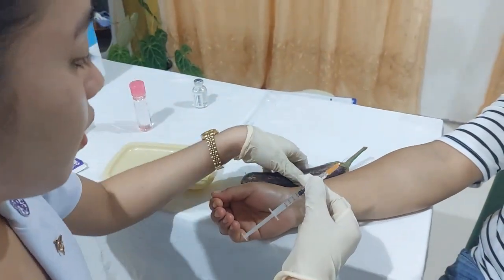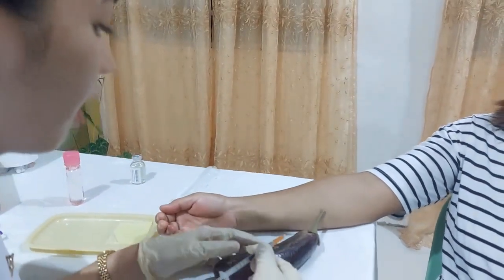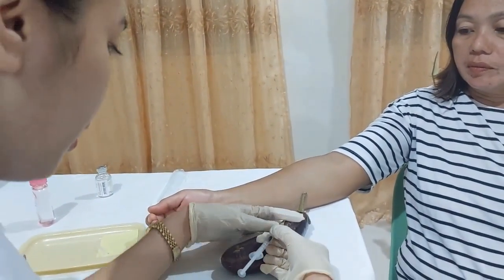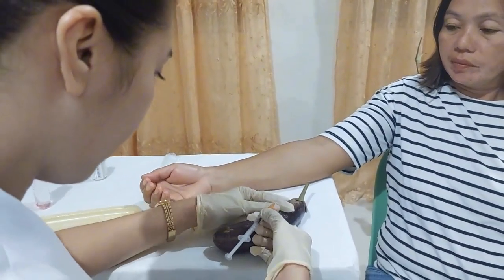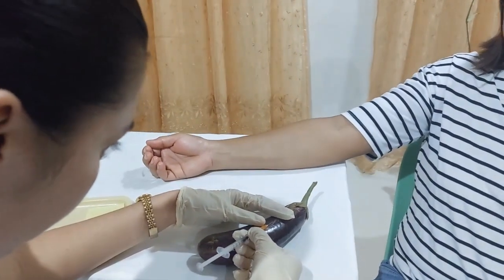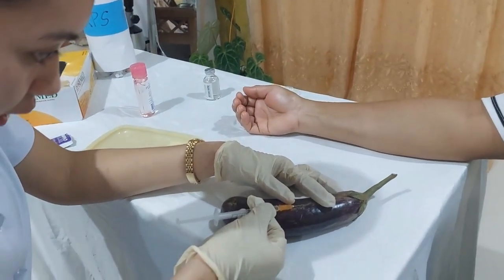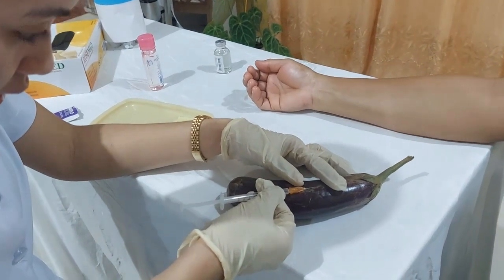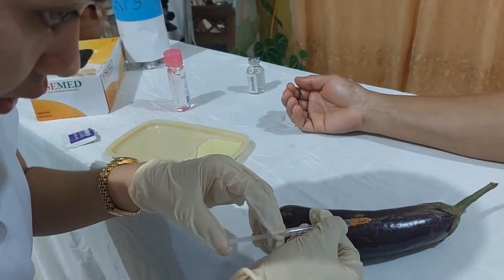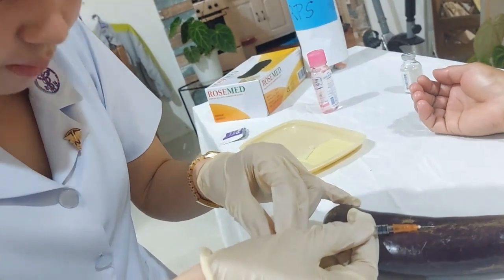our dominant hand will be the one to inject. For this demonstration, I'll be using an eggplant. So now our non-dominant hand will do the stretching. We must make sure that the bevel is up. Okay, and I'm going to inject it.